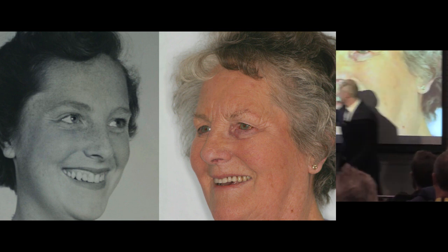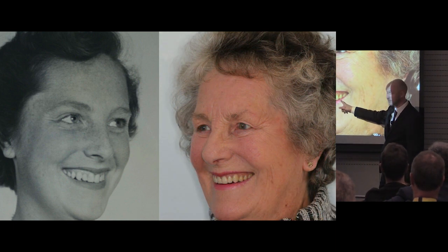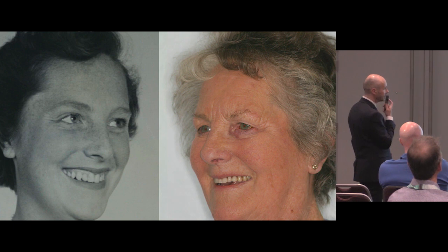And I love the transition from that to this. The only thing that's changed is these teeth. And if Rowan didn't have this as a reference, if we didn't have this as a reference, we wouldn't be able to do that. So the only thing that changes with her is the teeth, nothing else. Her earrings are the same, her jumper's the same. But it actually changes the whole of her, the way she looks, Muriel here. And what I'm trying to do, and what Rowan and I are trying to do, very much so, is to replicate nature. So if the patient was a class 1 patient, we put them in class 1.